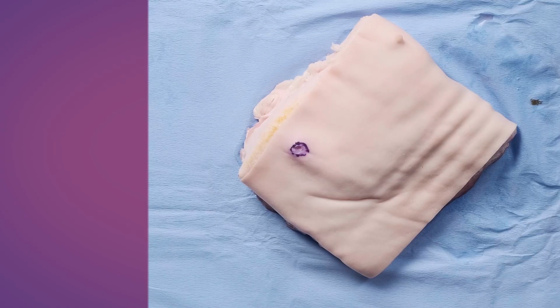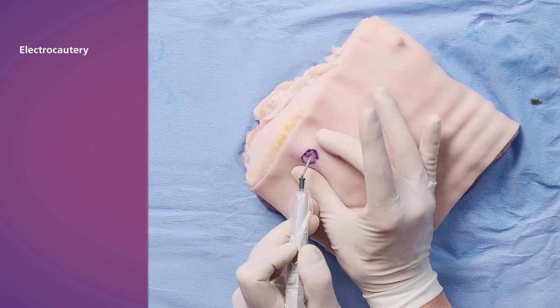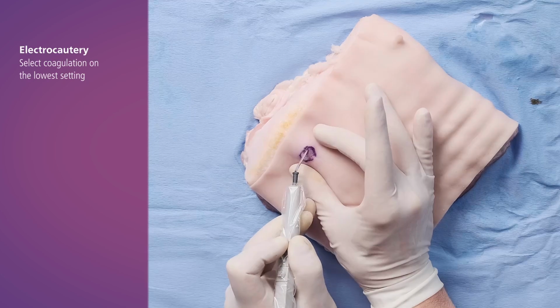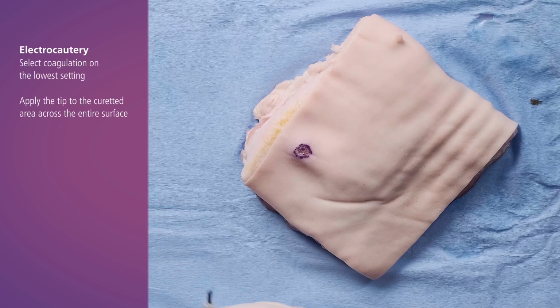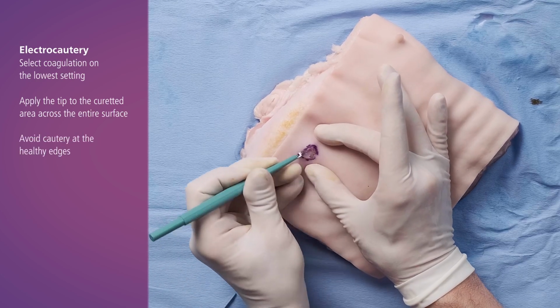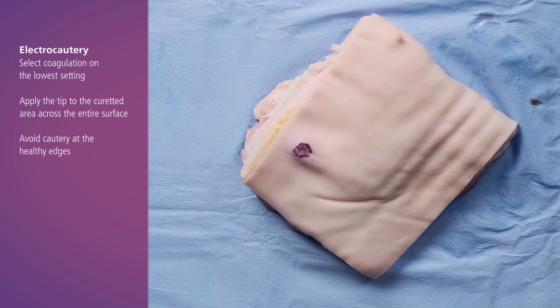Once curettage is complete, hemostasis is achieved using electrocautery. Select coagulation with the lowest setting that can achieve hemostasis. Apply the tip to the curetted area across the entire surface, and avoid using cautery on healthy edges, as this may increase scarring and delay healing.